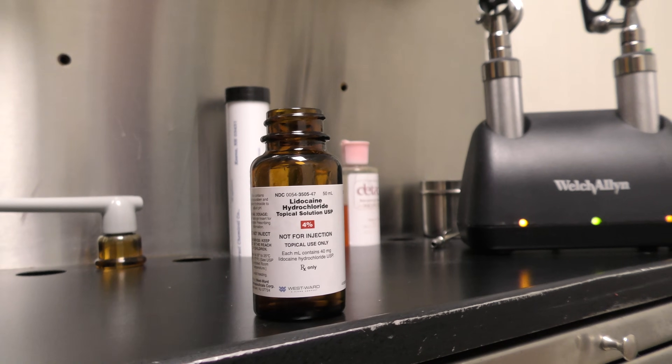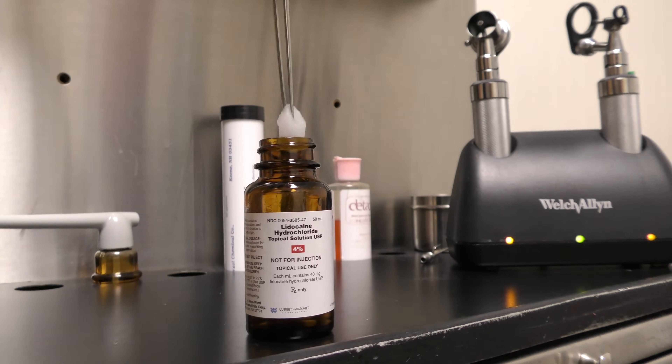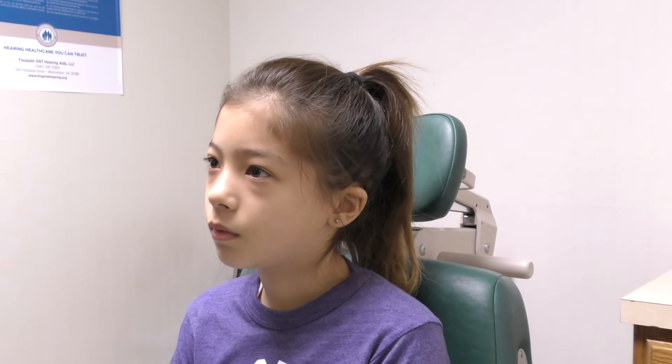First, a cotton ball soaked with 4% lidocaine is placed into the affected nasal cavity to numb the area to be cauterized. This step prevents it from hurting.